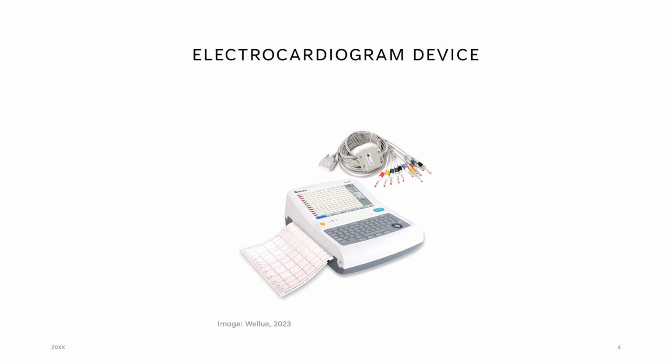If an ECG is done while presenting symptoms, it can help identify if there is reduced blood flow to the heart that could be causing the chest pains. The ECG can also provide information on enlarged hearts, heart defects, or other heart-related issues. So very important stuff.